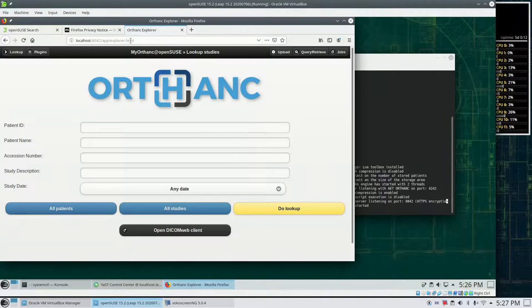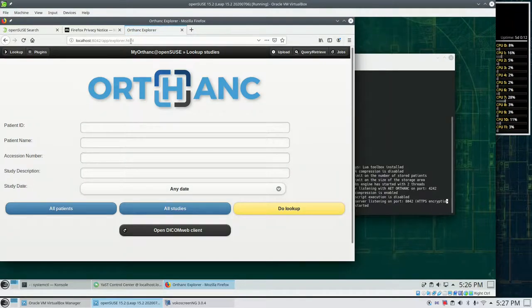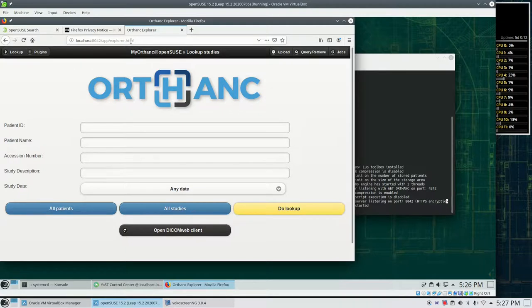Hey, there we are. Our Orthanc server is running and we could start with the next step.